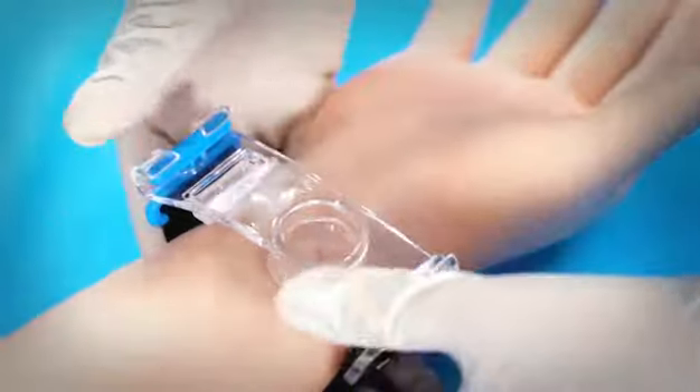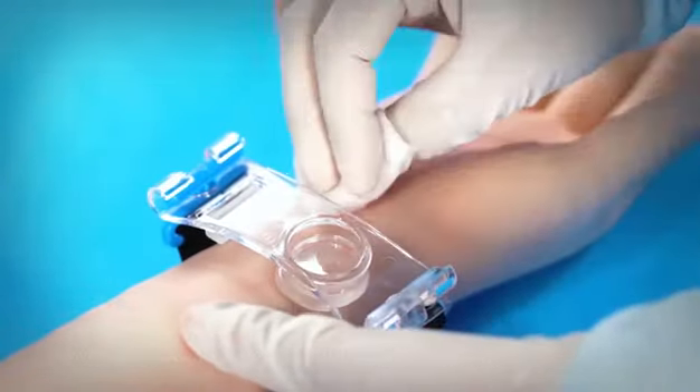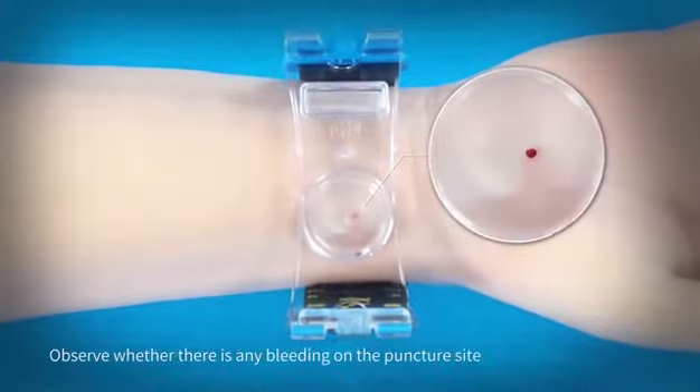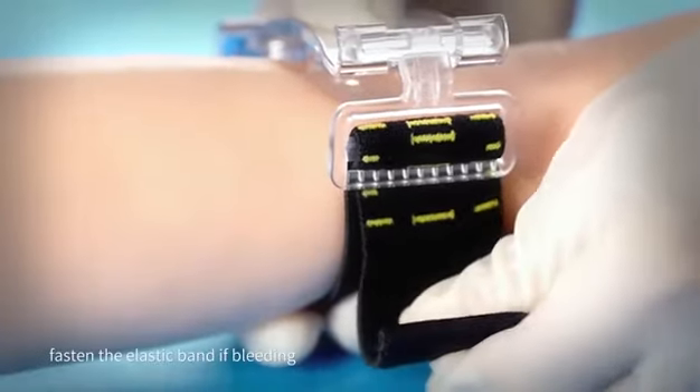During the procedure, pay careful attention to keep the balance of the force pad to avoid uplift to any side of the artery or ulnar area. Observe whether there is any bleeding on the puncture site, and fasten the elastic band if bleeding occurs.